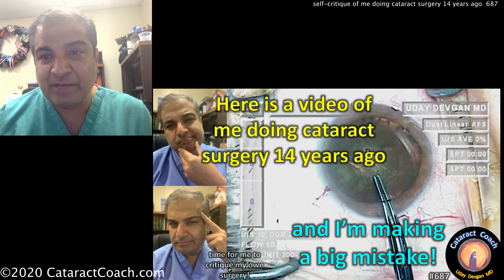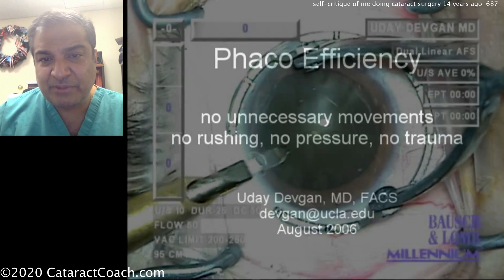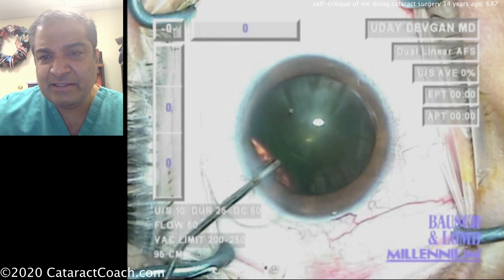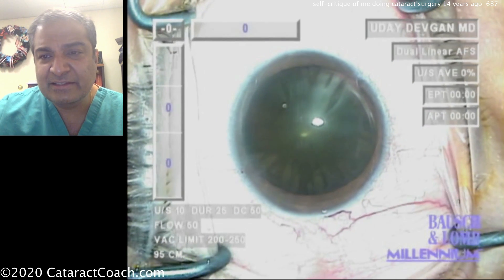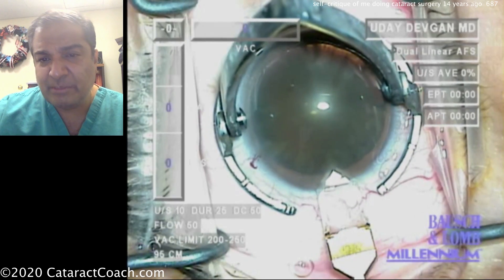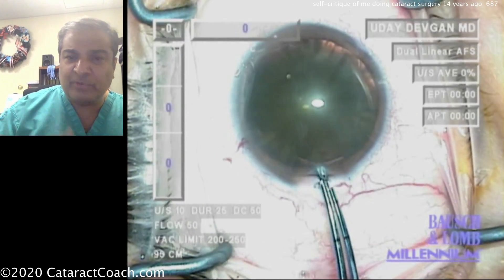Let's watch this video of me operating 14 years ago. You see the date — August 2006 — starting off the case. Here's a fixation ring, a diamond being used to make a paracentesis. That's pretty typical. It looks like a pretty reasonable cataract, not too dense. Here's the dispersive viscoelastic — good feel of the anterior chamber. And now time for the main incision, similar instruments to what I use now. There's a diamond, a little bit larger than we're using in modern day surgery — about a 3mm wide incision. Architecture looks good, good tunnel length, good balance of the roof and the floor of the incision.